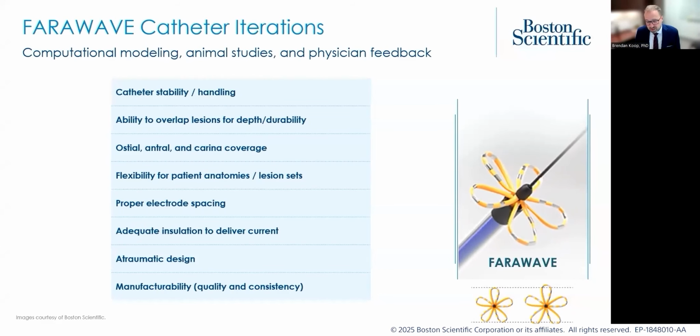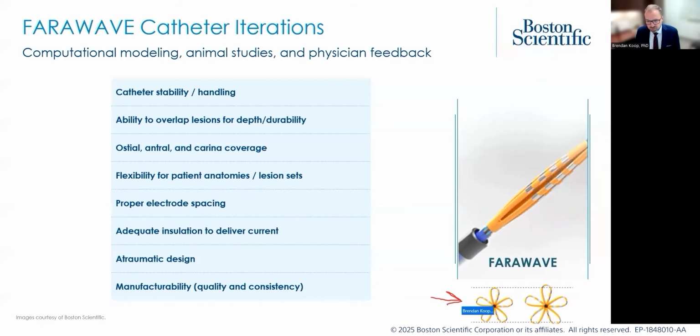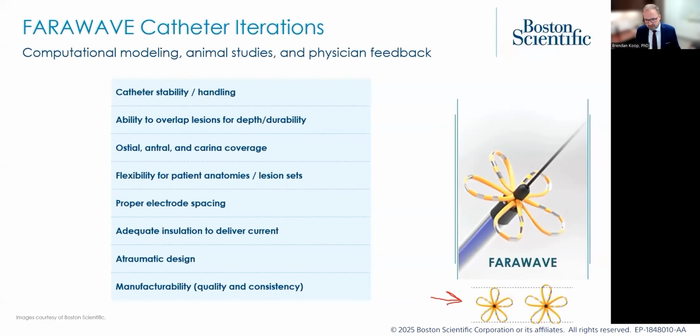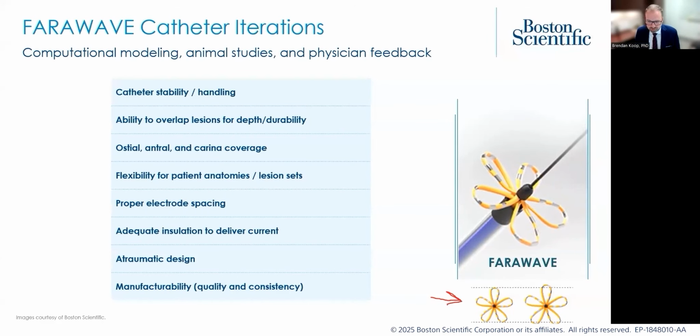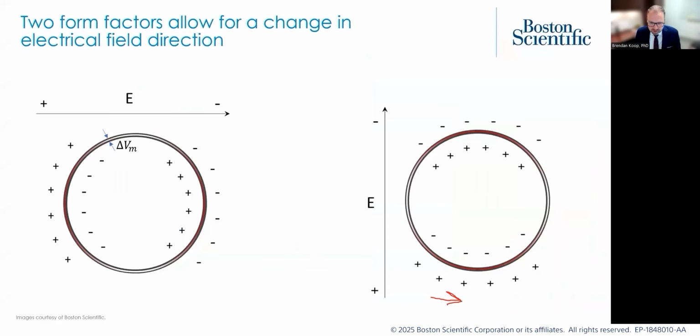And then another aspect is these different size catheters. You would think we would reuse the electrodes on the 31 millimeter and the 35 millimeter, but they're actually different between those two form factors. The electrode size and spacing is optimized differently for those different sizes so that you get a consistent electric field. So that gives you a flavor for some of the things that go into PFA system design for safe and effective PFA.